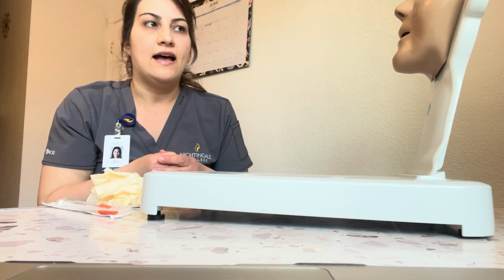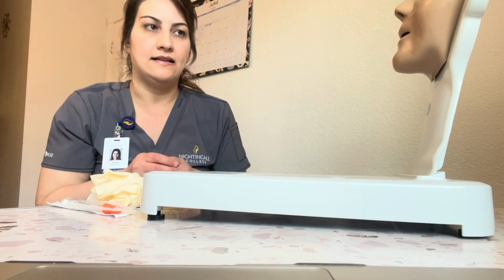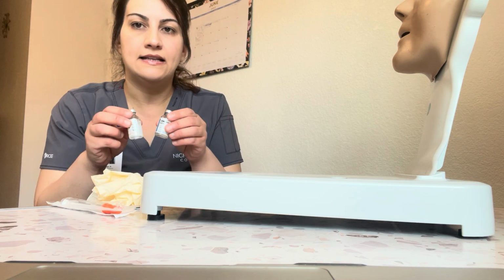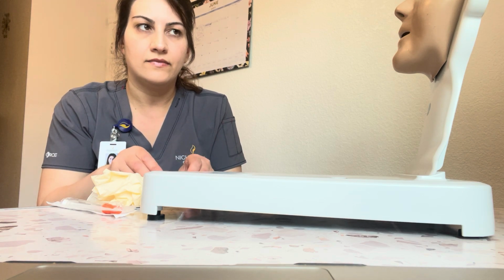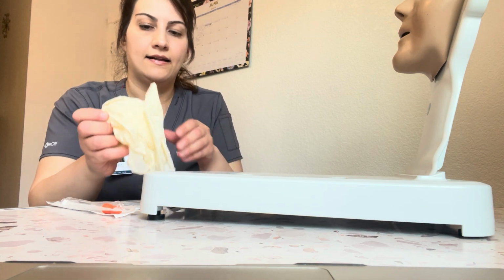All right, Miss Smith, your physician has ordered you medication. You're going to get it in one injection form. It is insulin, regular and intermediate insulin. Do you have any allergies? No allergies? Okay, second time verifying against MR with the medication. All right, so I'm going to perform hand hygiene here, and I'm going to put on my clean gloves.